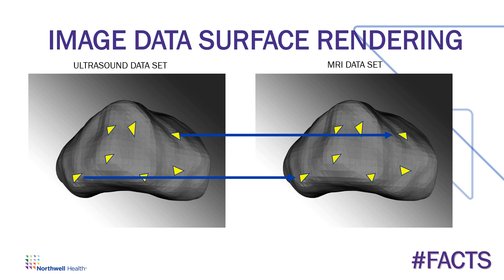We're able to adjust and overcome this error by focusing during the fusion biopsy itself to make any small adjustments needed. Again, this is what it appears to the computer — these are the two data sets and we want to merge them together. You can see the blue lines correlating with the triangles on the corresponding data set. This is how we fuse the image together.